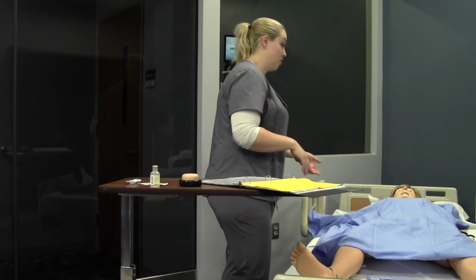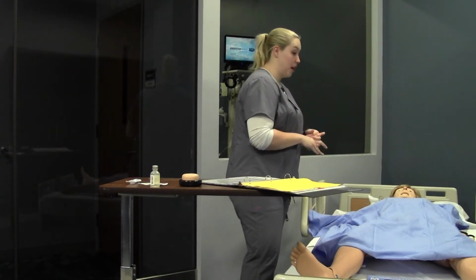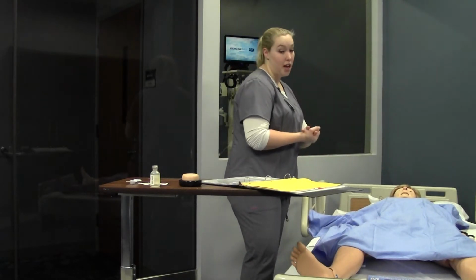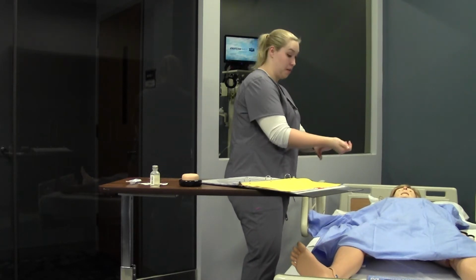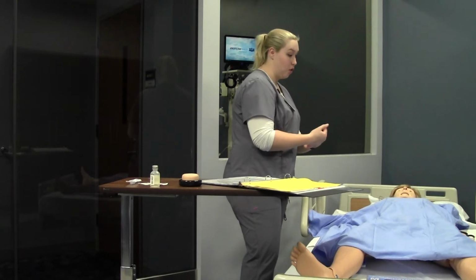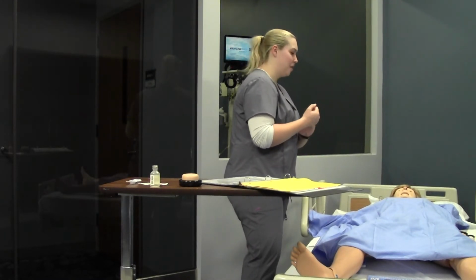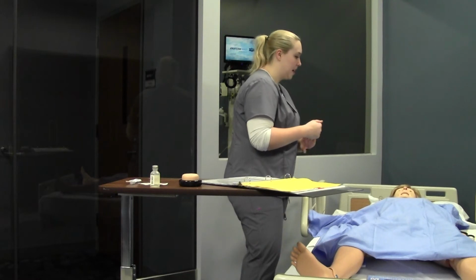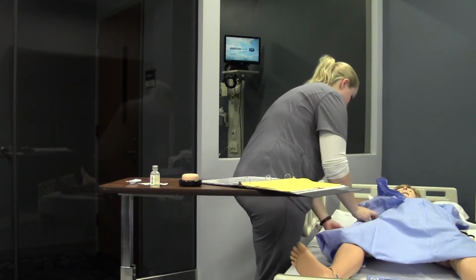Let's knock on the door, introduce, and perform AIDET. So Mr. Smith, my name is Erin. I'm going to be your nursing student today. I'm going to be giving you your TB test, or your tuberculin or tuberculosis test, which goes in your forearm. It takes about 5 minutes or so. You'll feel just a little bit of discomfort with just the needle stick. That is all. Can you tell me your name and your birthday? They'll tell you your name and birthday.